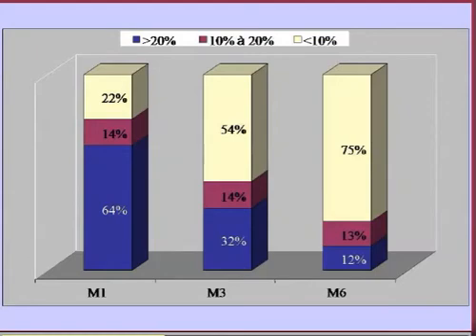And you can see that after 3 months, but better after 6 months, most of the students were able to accurately calculate the left ventricular stroke volume when compared to the expert, with an error of less than 20%. So, good technique, easy to train.